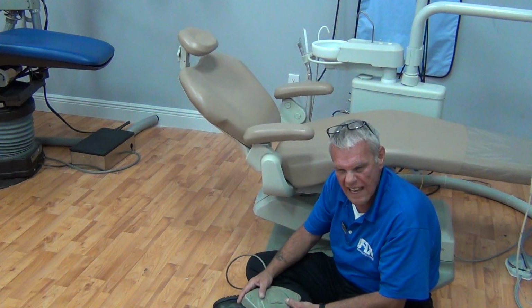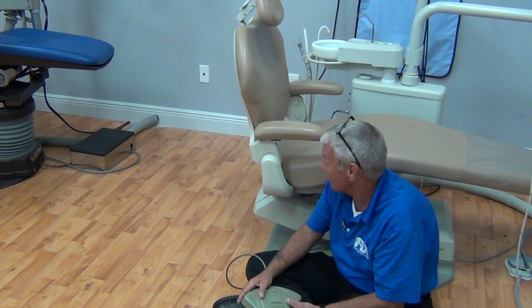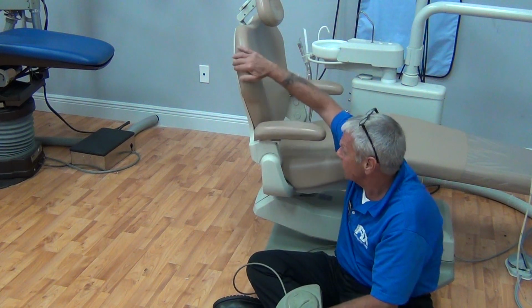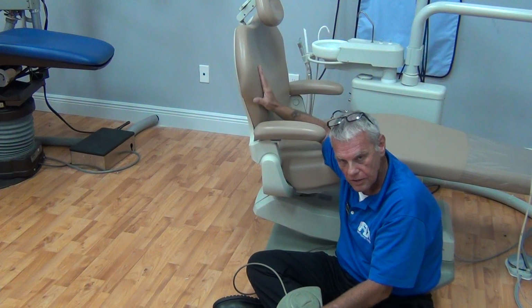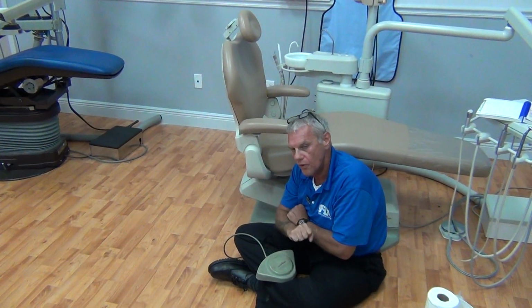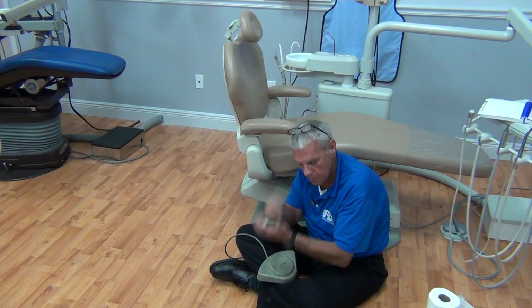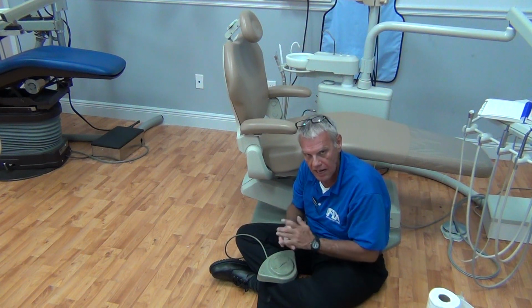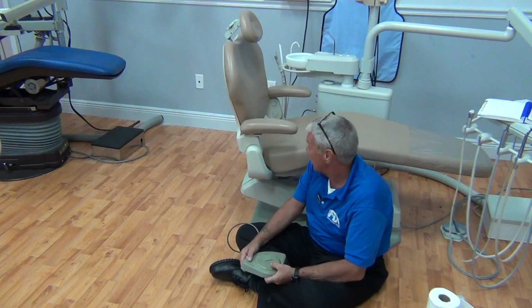We're listening for whining, the air noises I described to you earlier, and we're fine. We're also looking for stability and a lack of sponginess. It should feel like a definite surface with no sponginess or resiliency in it. It should be right there, and it is. It should stay as stable as an anvil on a stump. Okay, we're good.